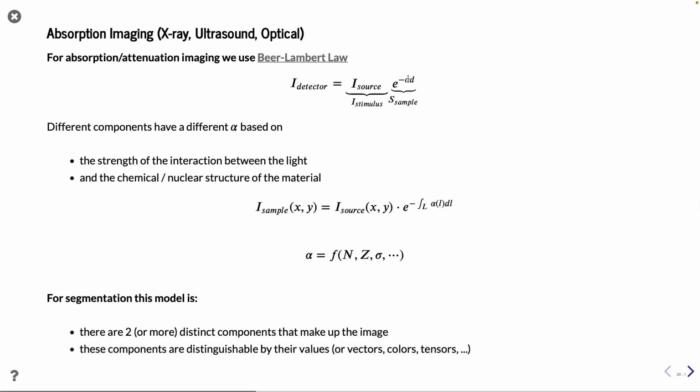In practice, this actually turns into the integral along the ray. So the distance is sensing what's happening along the ray, and that is summed up into the attenuation effect that we have. And the important thing is actually to see that you have two components in this exponent, because they will give us some troubles, as we will see.